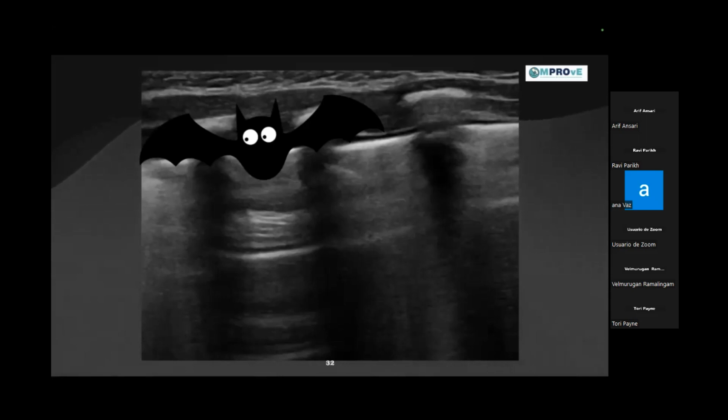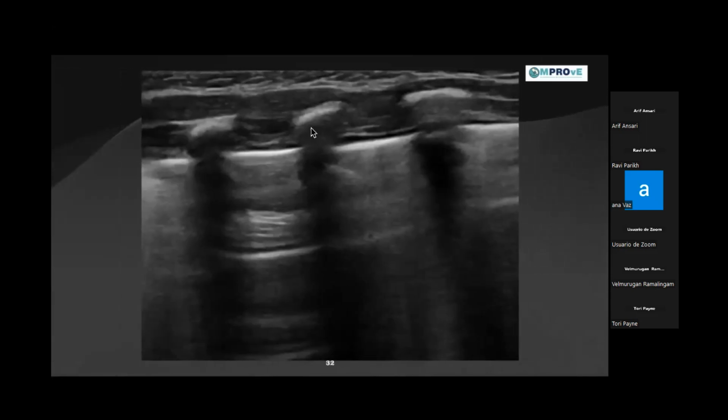Yeah, you should be able to see the clear ribs, rib shadows, a clear pleural line. And when you see this, then you know we are at 90 degrees over the pleura, and this is the image you interpret. If you make a slight angulation movement, either you're going to lose the shadow, or you might be seeing more of a B line as well, because it depends on how you are propagating the ultrasound waves onto the lung, or rather onto the pleura.